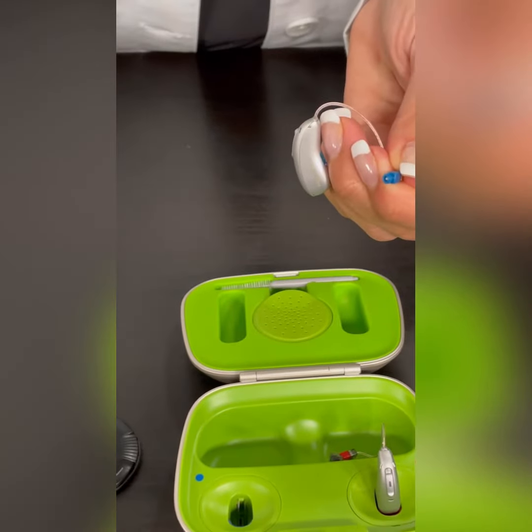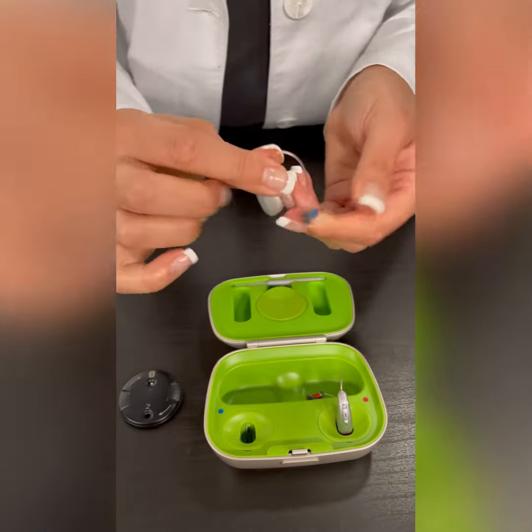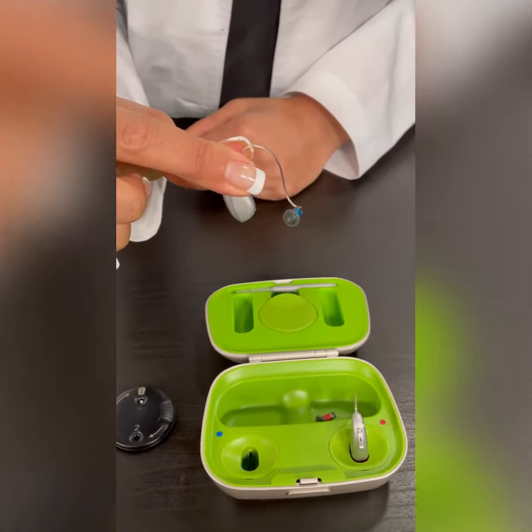You will then put your dome back on. Just slide it right back on. And here you are with a new filter.